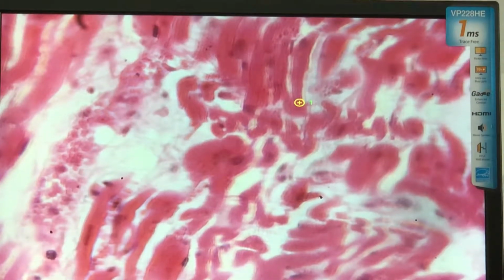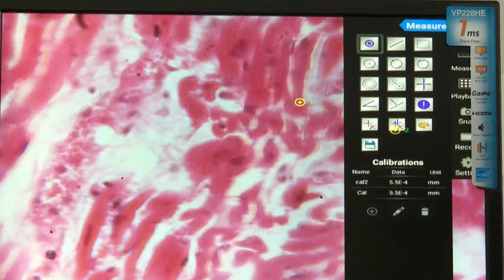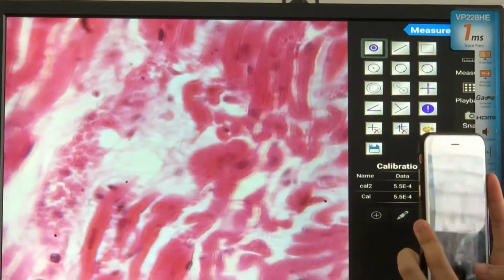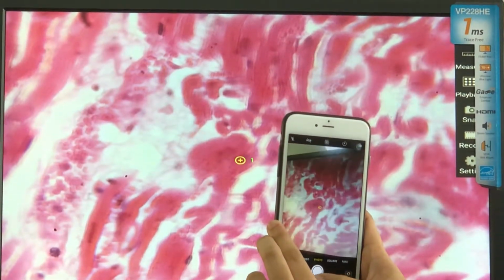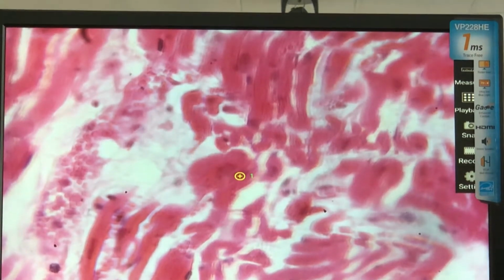Okay, so this one, did you see the nucleus in high power objective? If you are an expert in histology, when I point at the nucleus, this is already big enough for a cardiac tissue. It's so big it looks like a boxcar.